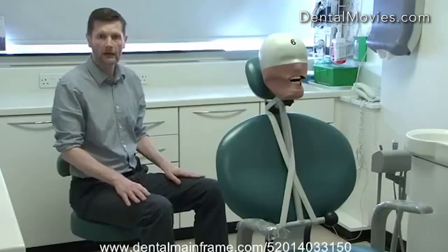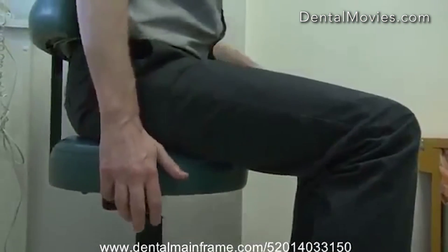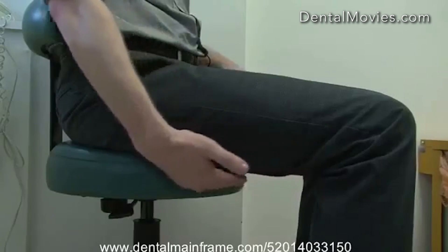This chair is actually slightly too low for me. Chairs should be height adjustable so that the top surface of the thighs is slightly pointing downwards and the undersurface of the thighs is parallel with the floor.